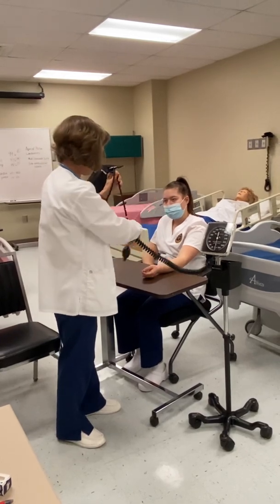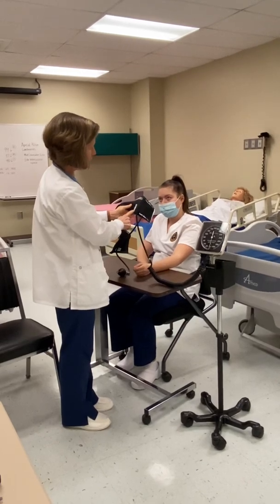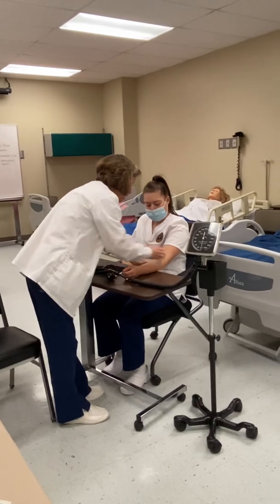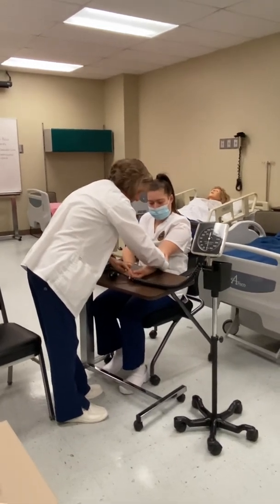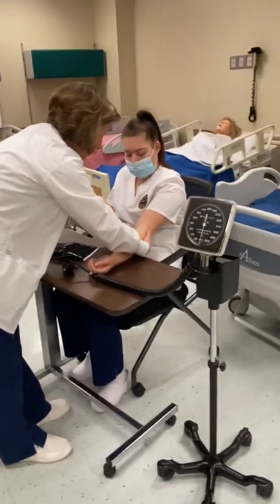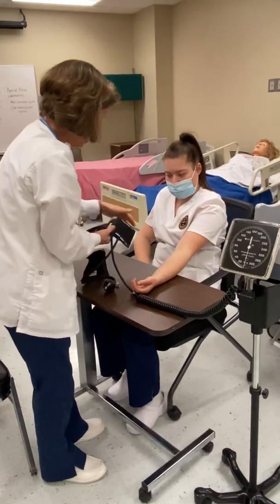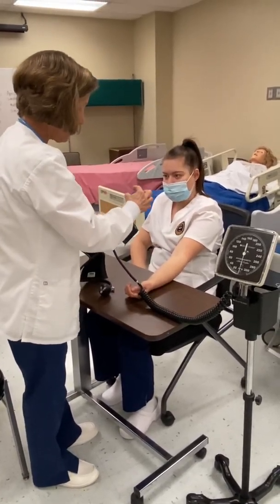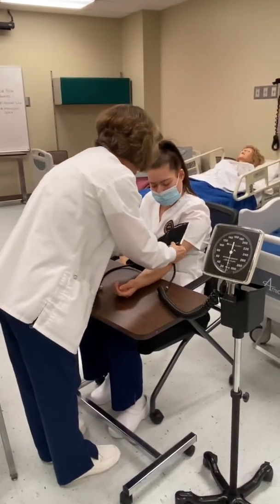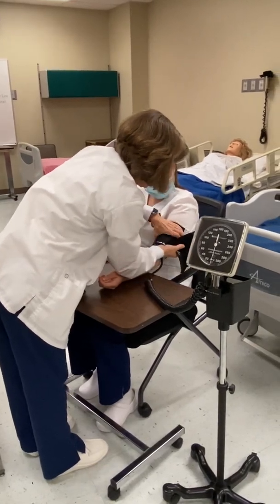I'm going to look for the artery mark on the cuff — sometimes it looks like a bullseye. I'll line that up with her brachial pulse, which is on the pinky side at the bend of the arm. That's where I'm going to put my cuff. You want the cuff to be about one to two inches above the bend in the arm, and make sure you get a good snug fit.